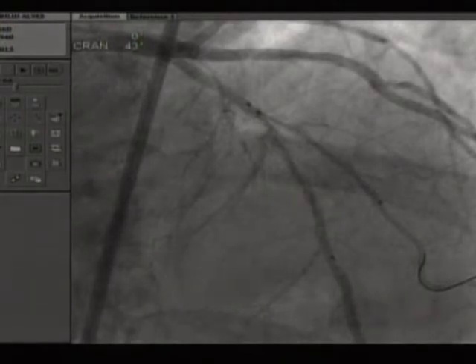Here it looks good. It's difficult to say 100% that it is perfect. Probably push it a little bit out more, but this is good. I mean, it's a crush. A little bit more proximal. Yeah, I might bring it a little more proximal. I don't know where that stent sits on that balloon, but I don't know about the patient.